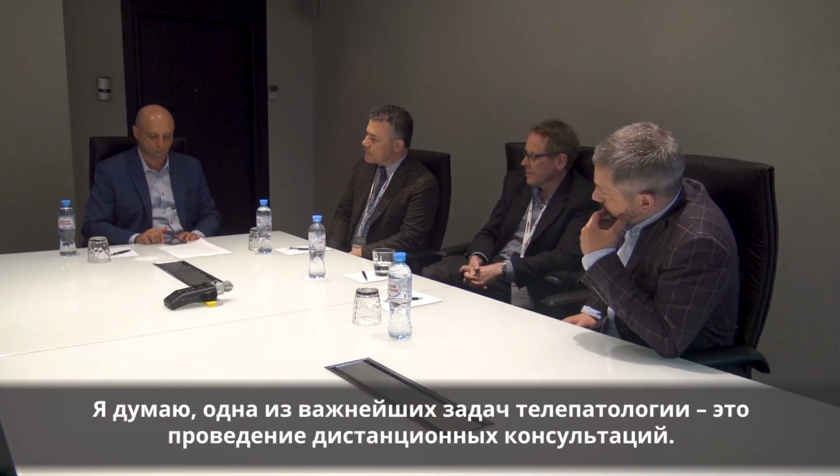I think in the second phase, in terms of diagnostic pathology, its main role will probably be in consultation, for an easy and direct way to get expert consultation by institutions that might not have specific areas of specialization, or for long distances, like international consultation through whole slide imaging. We've begun using it for our tumor boards.